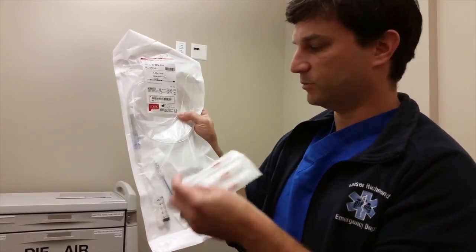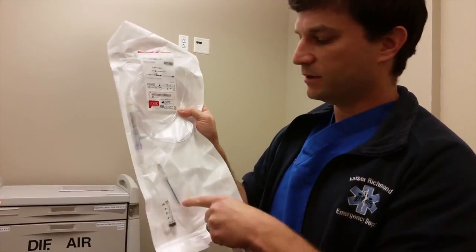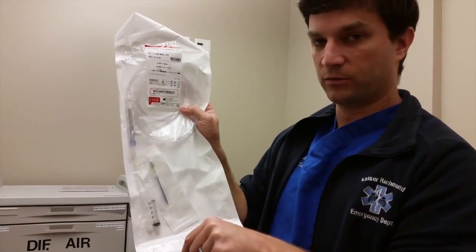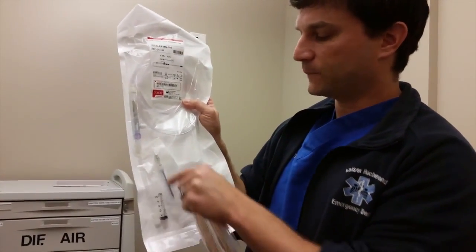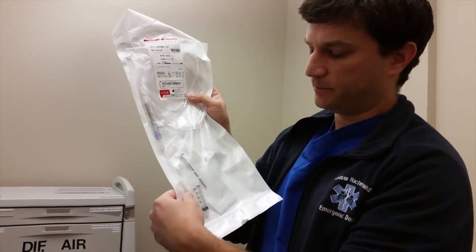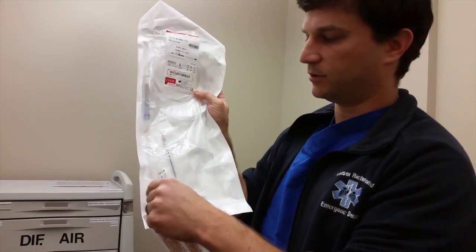So we have these things as backups, but technically you could just take this out and use this in most cases. Take this out, put your syringe on here, enter in, slide your catheter over as you get air bubbles, and then you're going to hook it directly up to this port here, okay, at the end, and it's got a flexible tubing on it, so you don't have a rigid attachment to your catheter.